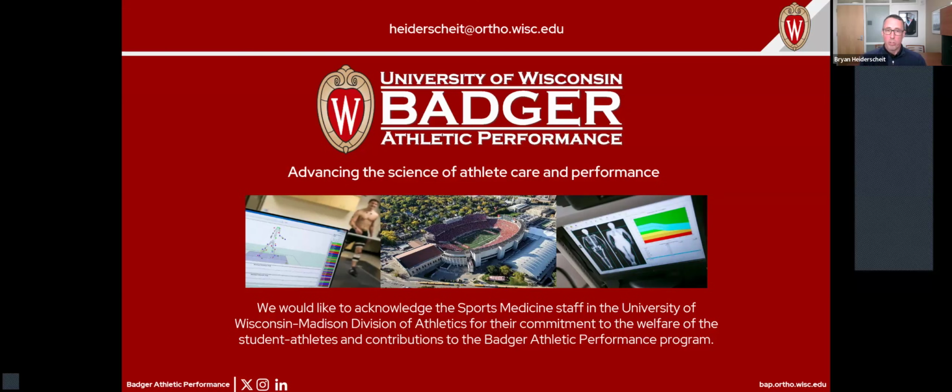I think there's an opportunity to use it for the anterior inferior tib fib ligament, but then even looking at jumping to other ligaments, whether you're talking about the MCL of the knee, LCL of the knee, UCL at the elbow. I think there's an opportunity here to really start to explore additional applications of this technique.